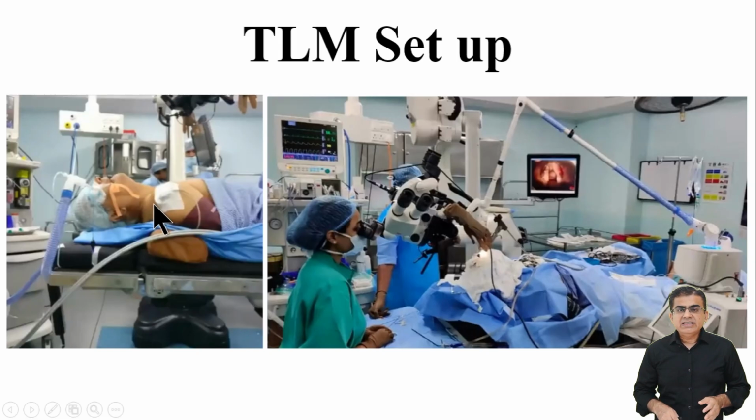Now look at the photo on the right. You can see the surgeon actively working. He is looking directly into the surgical microscope. Notice how comfortably his arms are resting. He uses one hand to control the laser joystick. He uses the other hand to work with tiny micro instruments. This comfortable setup is exactly what gives us perfect stability and precision during this surgery.